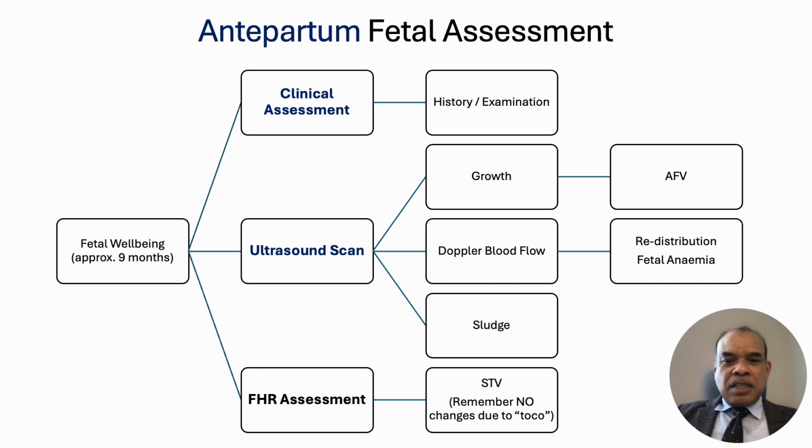And also the short-term variability may be detected by the computer, which is programmed in NICE guideline or similar guidelines which have got population-based parameters which have no chance of individualizing care, and they might give a false reassurance saying that STV is normal. And this is the reason we are going to use the CAUTION checklist.